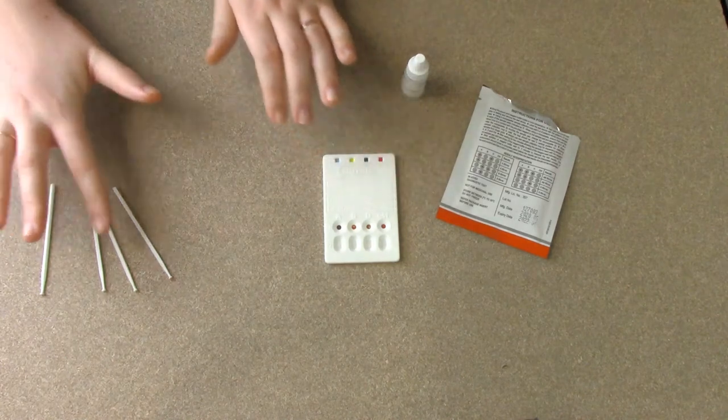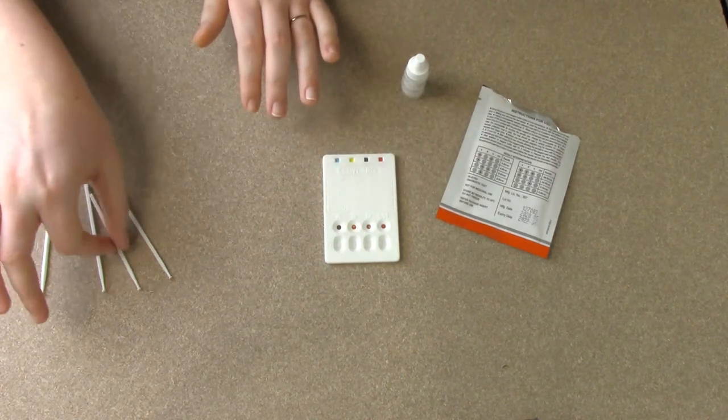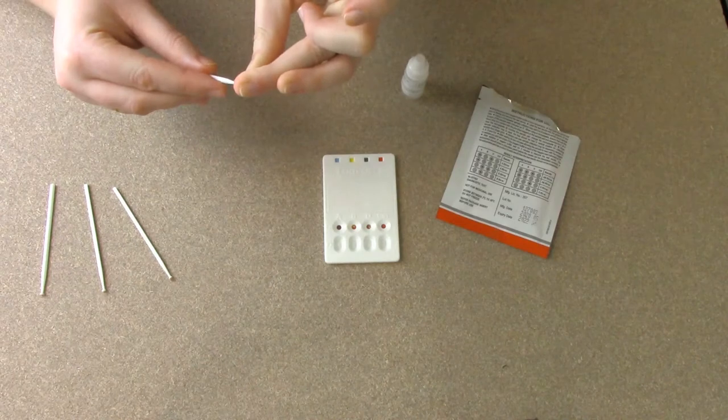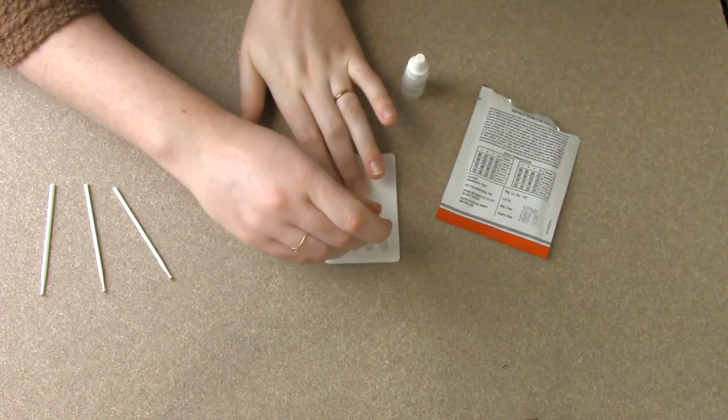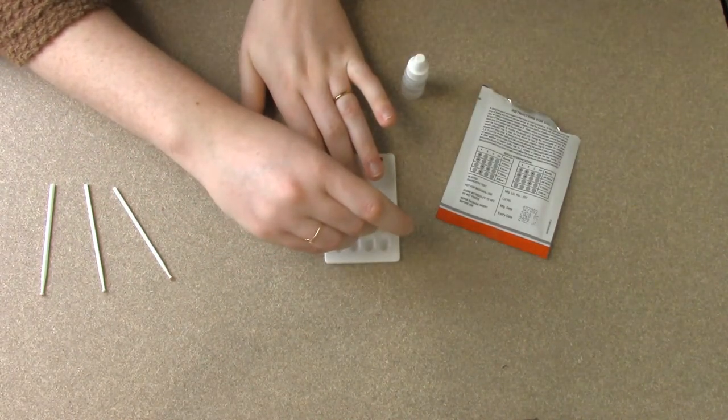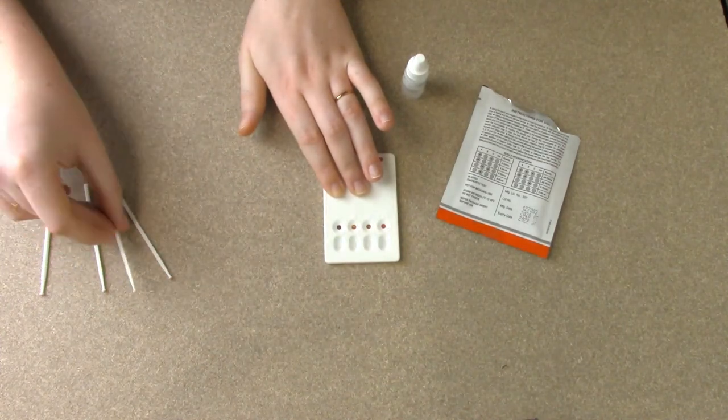Great. So I kept it in order A, B, D, and control. If you need to add any more blood, and look, it looks like D almost could use a little additional blood. So I'm just going to add a little bit in there using the same collection stick that I used before.